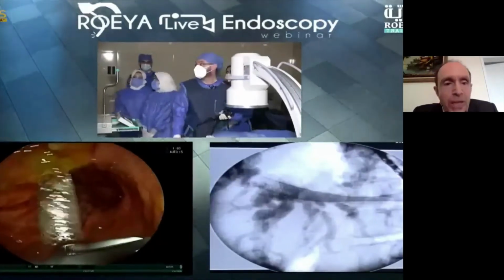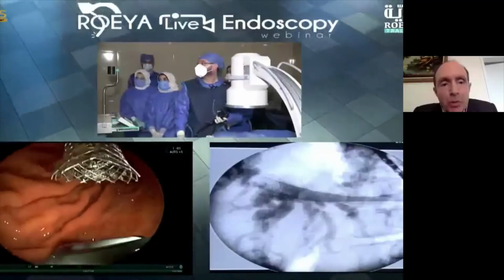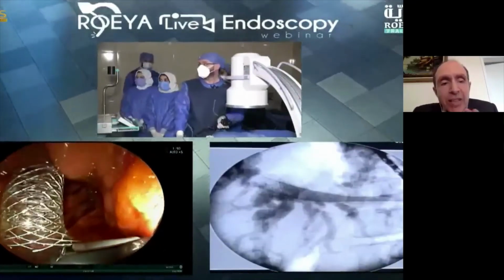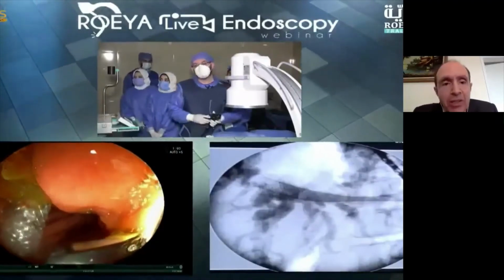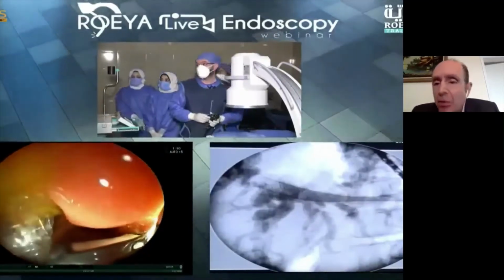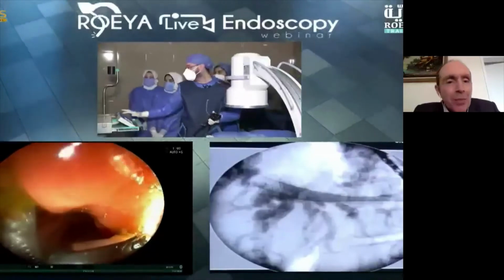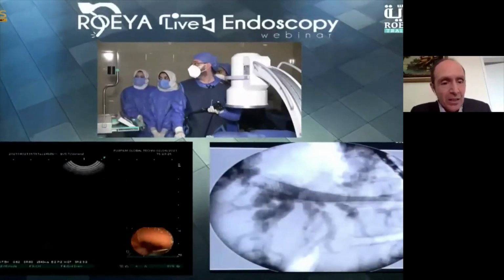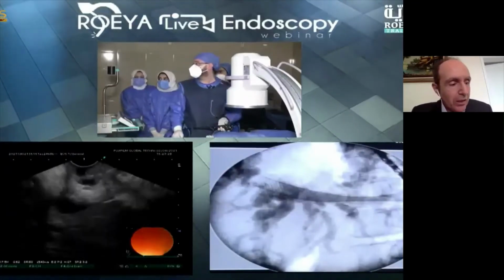Perfectly, I fully agree. And let me tell you that you performed the procedure so nicely that it gave us the impression that it's easy. But let me tell the audience that it's not easy, like Professor Altonbary made it appear. Okay, so congratulations. So we will now move to the FNB as the last step from the lesion itself.